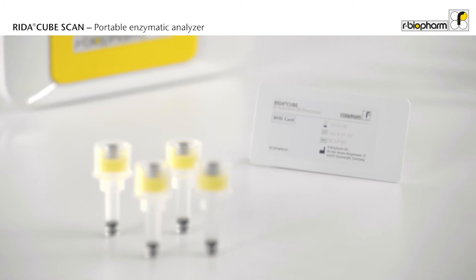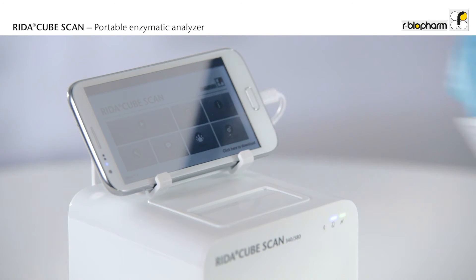Each kit includes an RFID card which contains the full test procedure and the calibration curve. There is no need to enter any settings — just place the RFID card on the analyzer and it is ready to start.